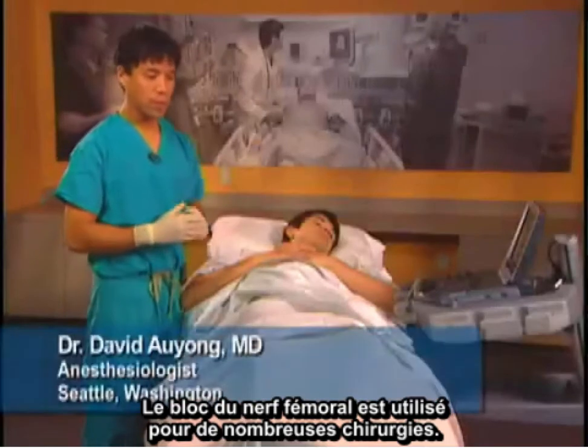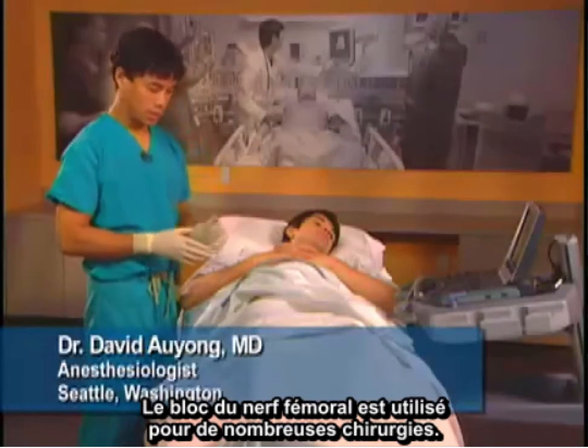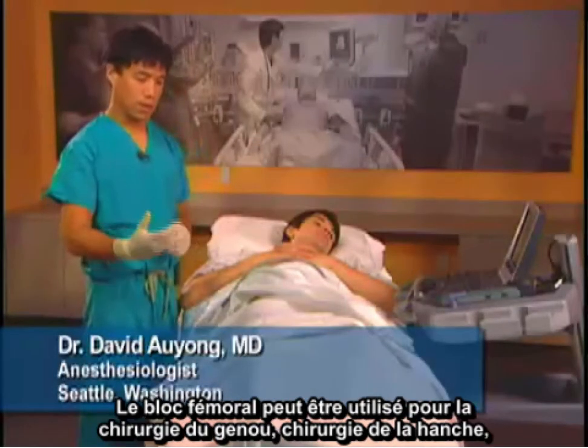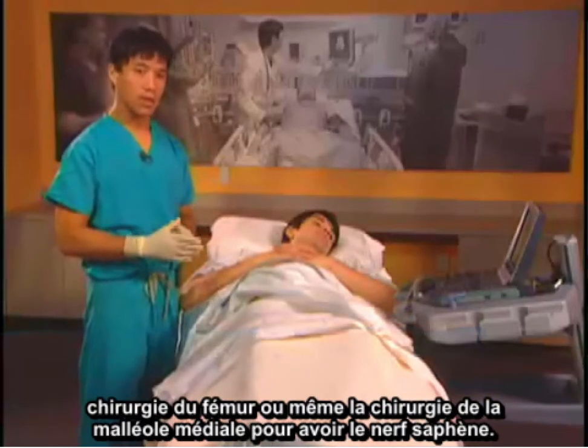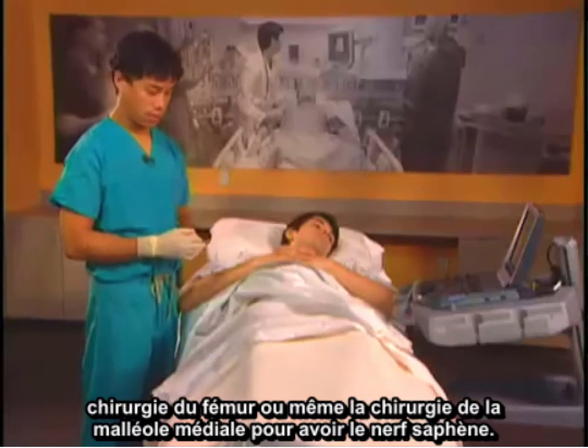The femoral nerve block is used for many different surgeries. It can be used for knee surgery, hip surgery, femur surgery, or even medial ankle surgery to get the saphenous nerve.